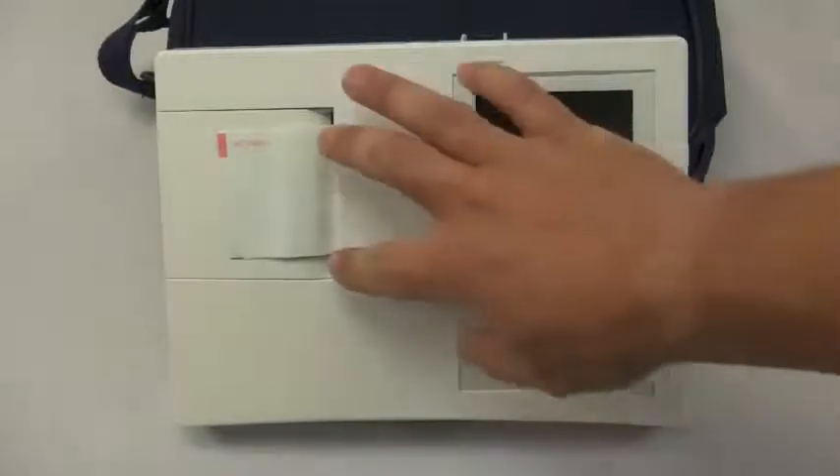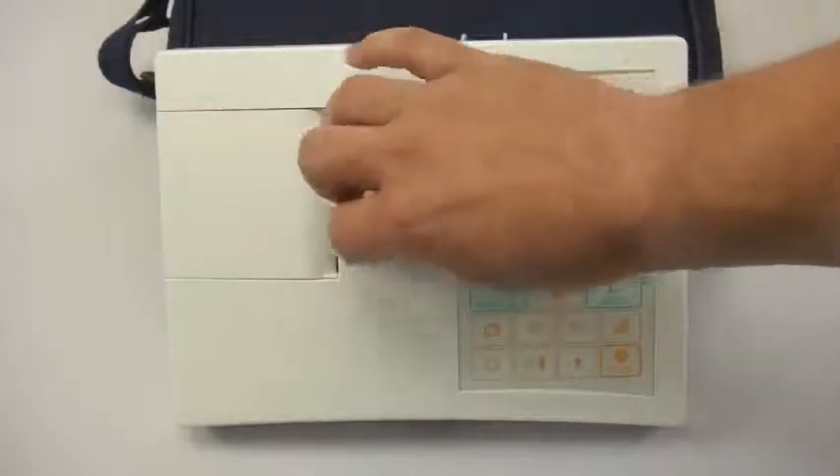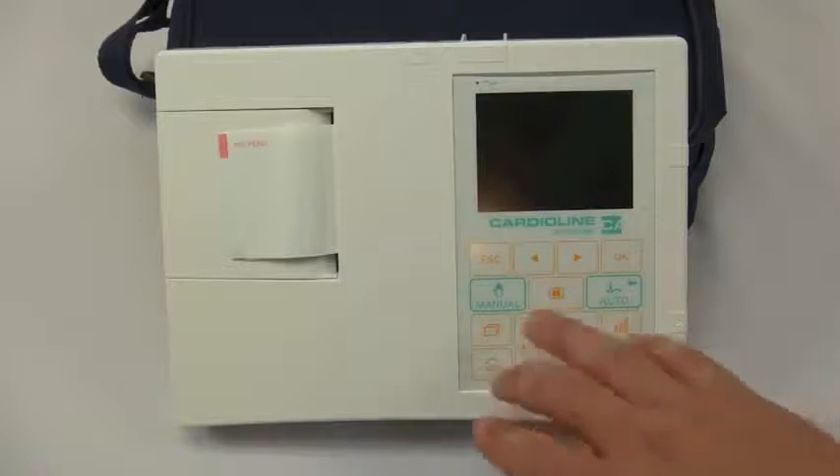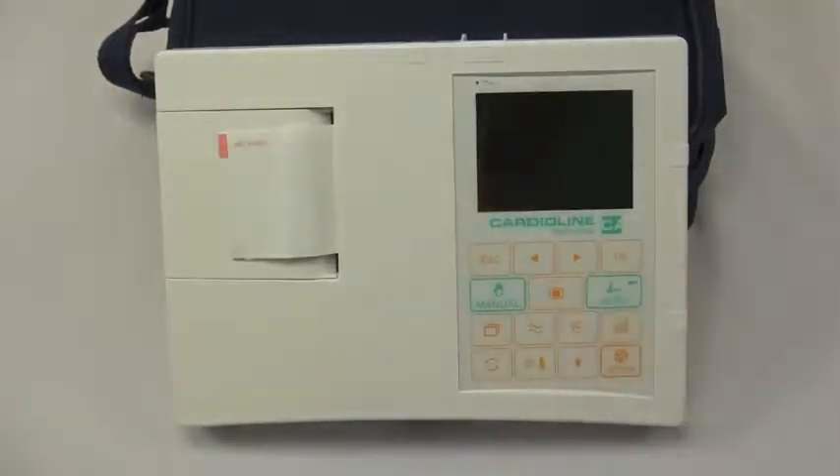The AR600 features a 3-lead printer with a small strip print. You will notice that the AR600 does not have a keyboard — it does have a small keypad but does not feature a more traditional full keyboard. The AR1200 and AR2100 products do have that, and we have separate videos available for those devices.